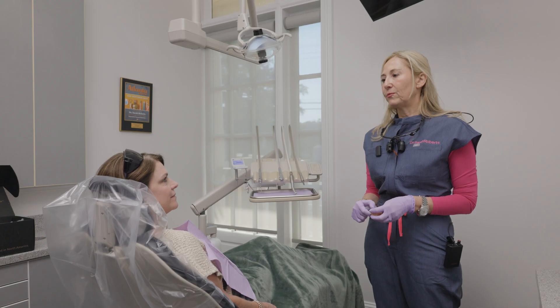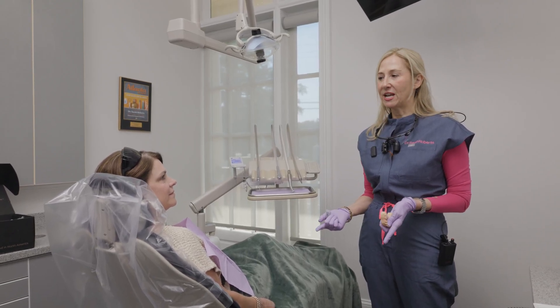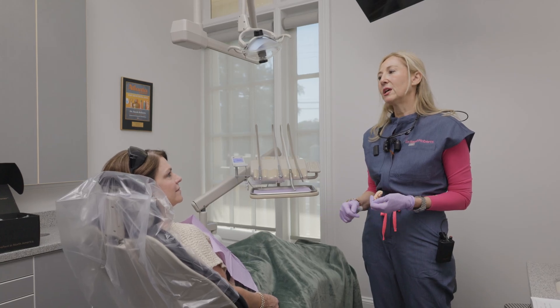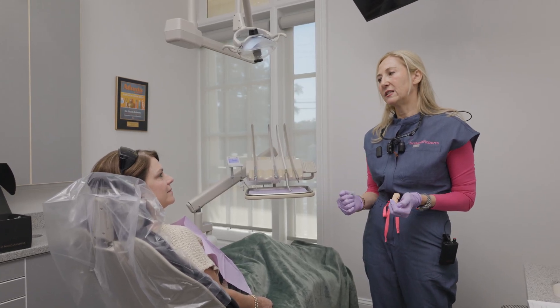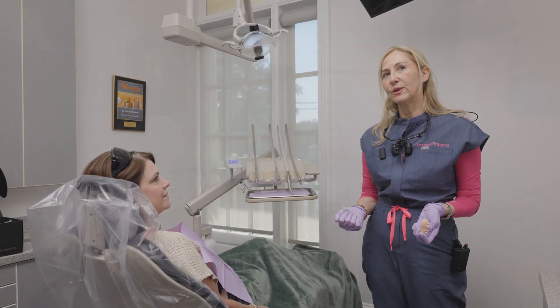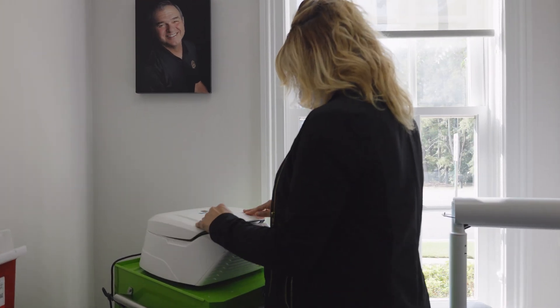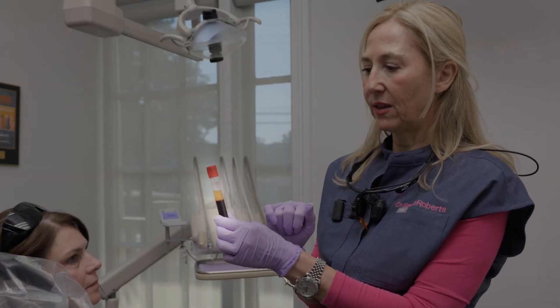Before we started, Robin had presented to me with a tooth that she had fractured, so we had to remove that tooth. In doing so, we needed to bone graft, and when we did the bone graft we prepared some PRP.